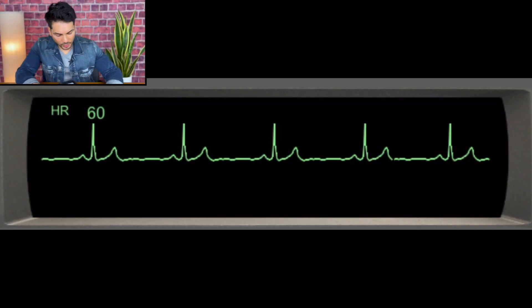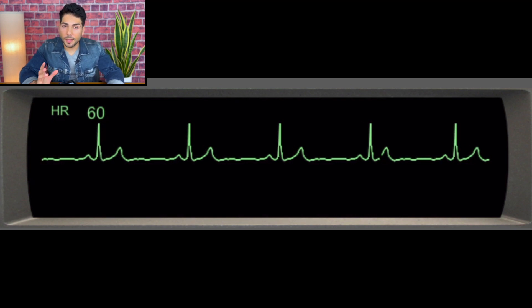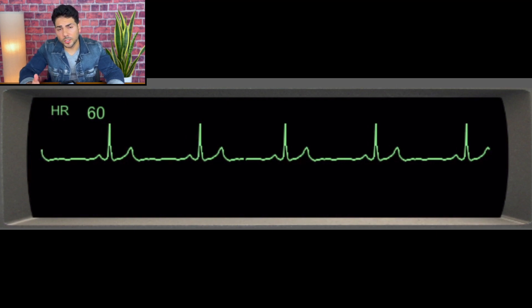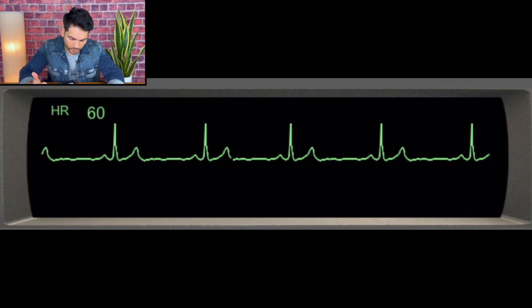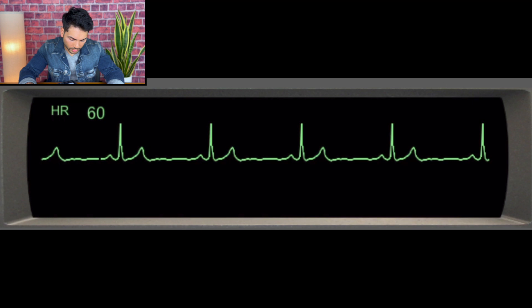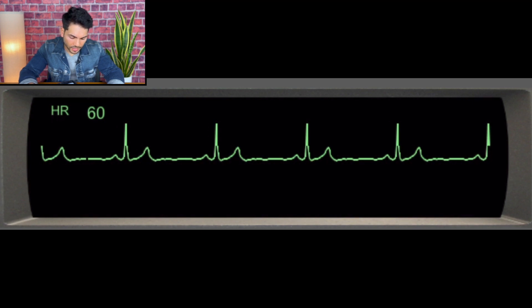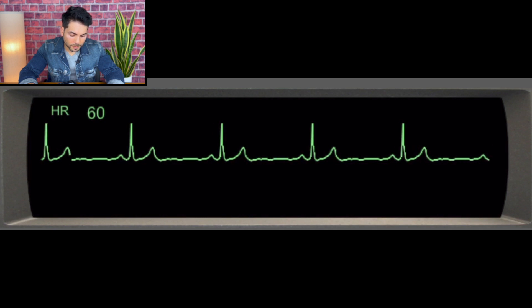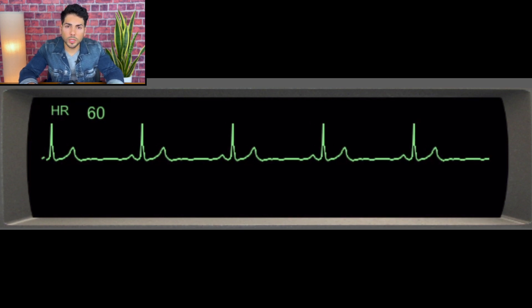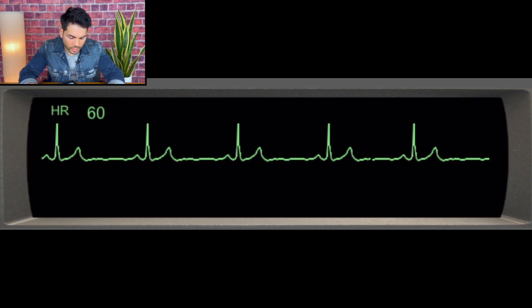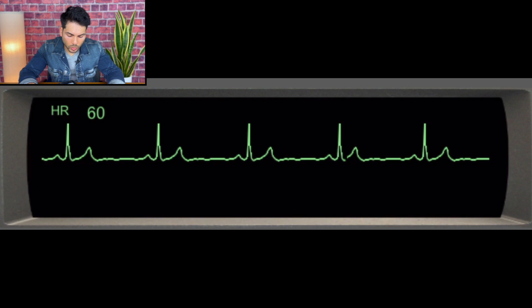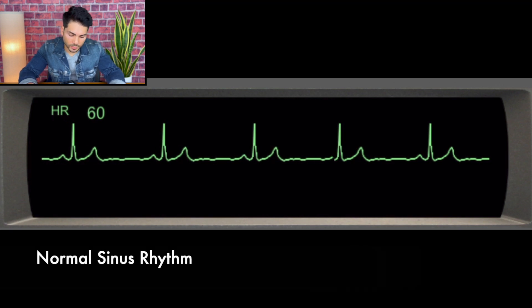Let's practice. Looking at this telemetry, remember to follow the five questions. First: are there any P waves? Yes, there are P waves. Is there a P wave for every QRS? Yes, in a one-to-one fashion. Is the rhythm regular or irregular? We look at the R-to-R distance — it's the same, so it's regular. Is the QRS narrow or wide? It's narrow. Is the PR interval prolonged? No, it's normal. We can conclude this is a normal sinus rhythm.